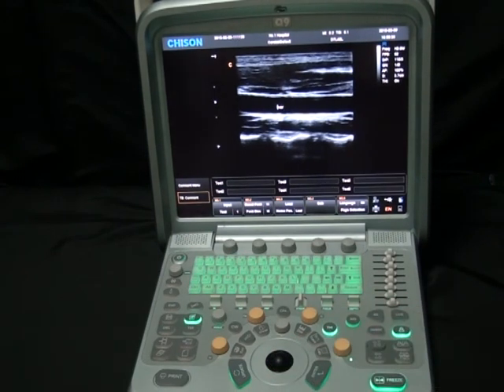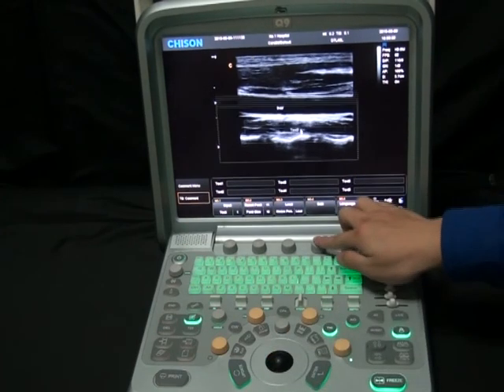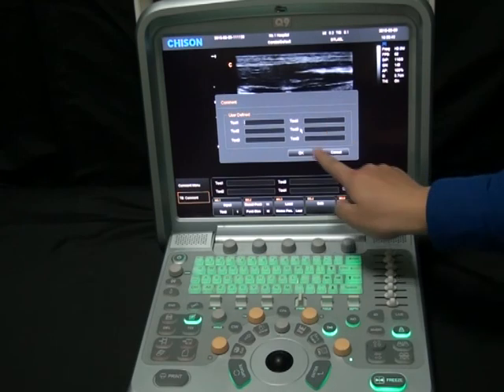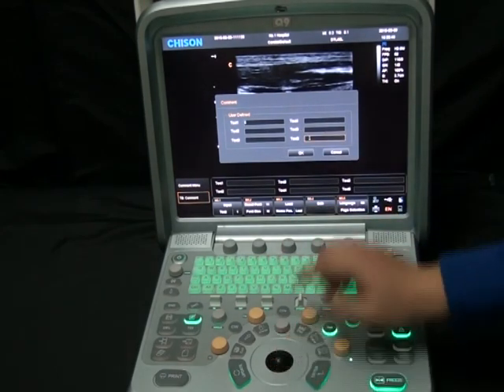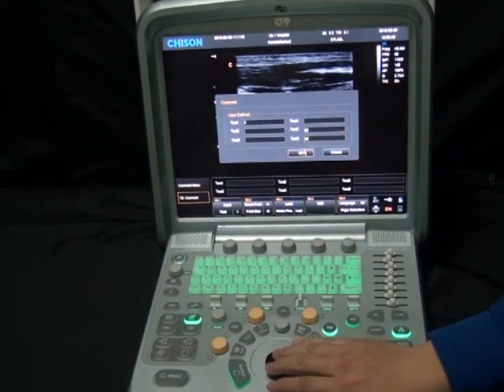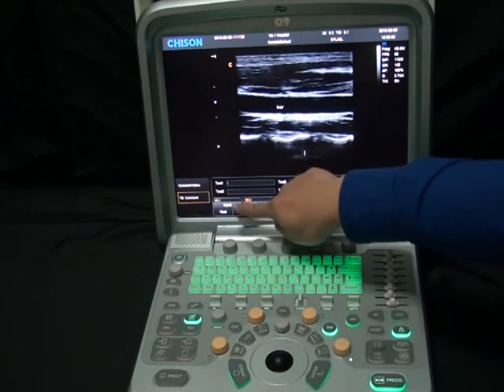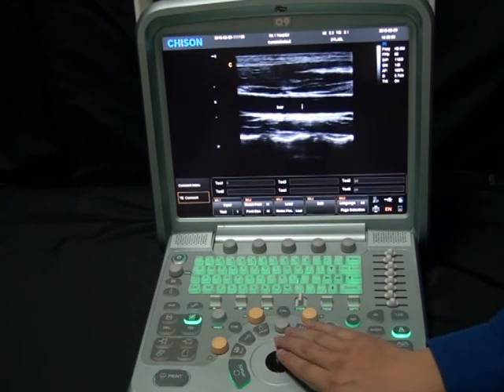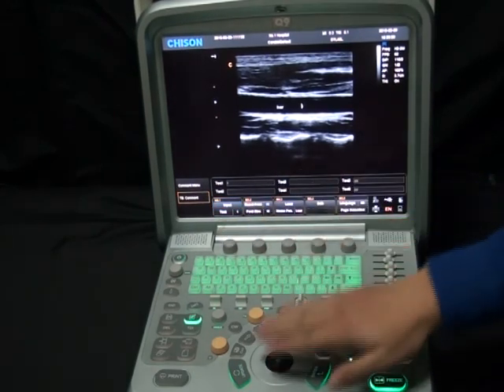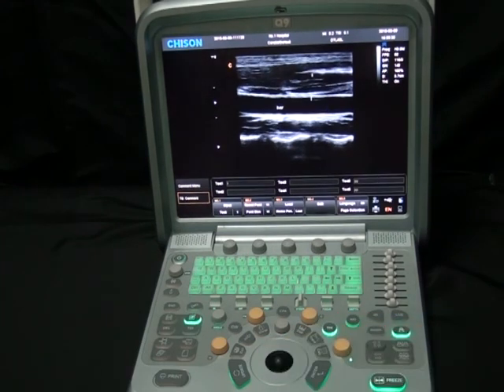We can also add our own quick comments. Here at number 4, we click Edit, and it will allow me to add custom comments that would come down right here for quick use. You would enter it here. Click OK. If you want to add that, we'll use this input. I want to select text 1, push down for input, and it automatically goes up on the screen. I will click Enter, and I can move it elsewhere on the screen and click Enter again.